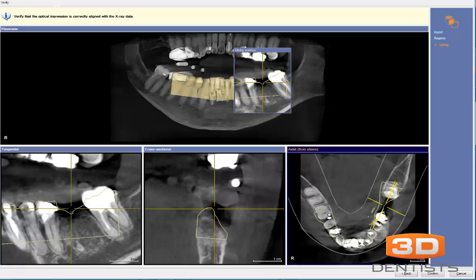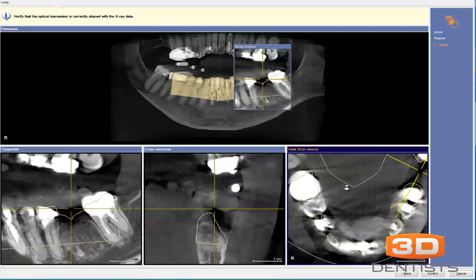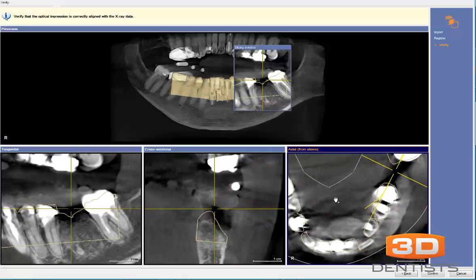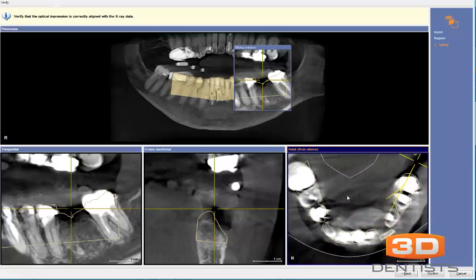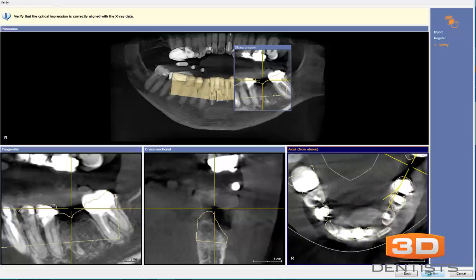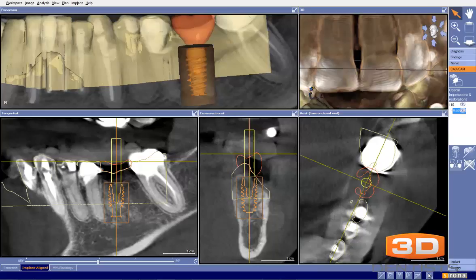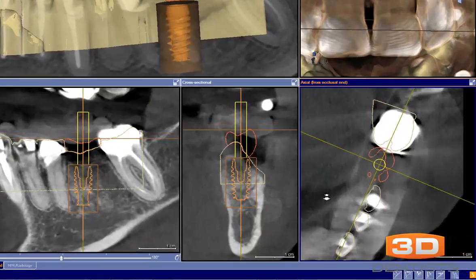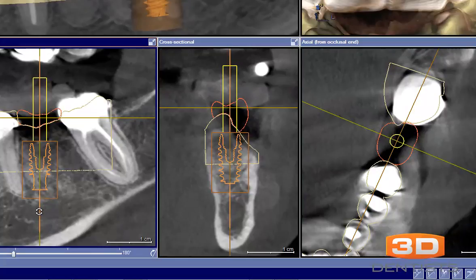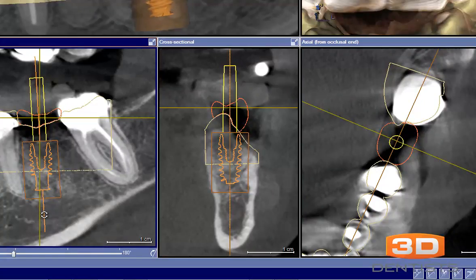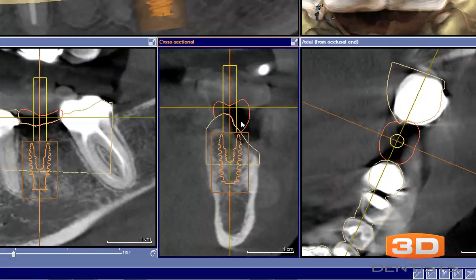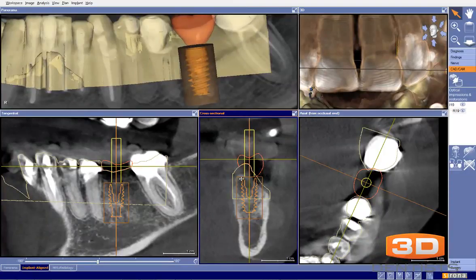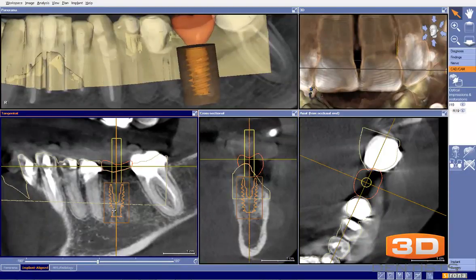Here we can see that we have a fairly accurate integration. It won't always look completely accurate around the areas of scatter, because the scatter itself makes the teeth look a little odd-shaped there. But this is going to be pretty accurate. Now from this, we can go through and idealize our plan. We can see that we need to tilt that implant to get the screw access a little bit to the mesial, and maybe tilt the implant a little to the lingual to get the screw access directly through the central groove. This would be my final plan for this particular implant.